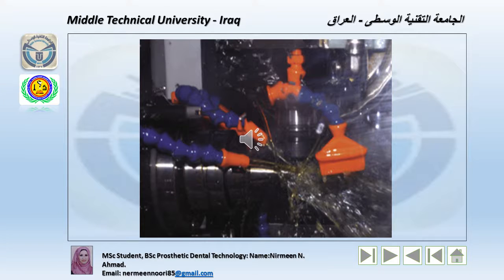And also, this machine mills long rods of commercially pure titanium within its milling chamber. Approximately 12 different abutments can be cut out of each foot length of the titanium rod. The milling takes place under a copious amount of cooling water spray.